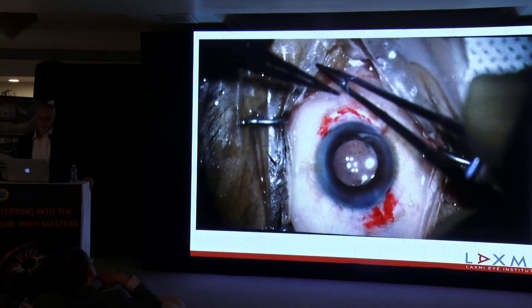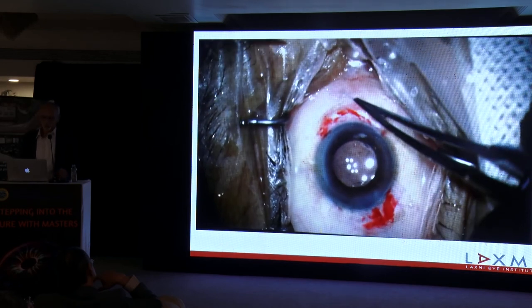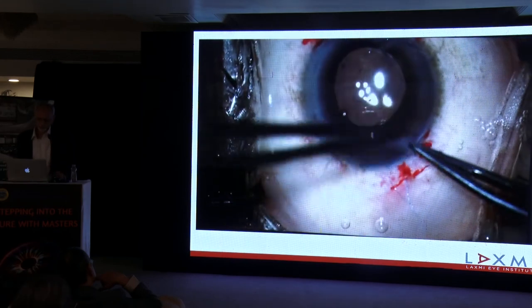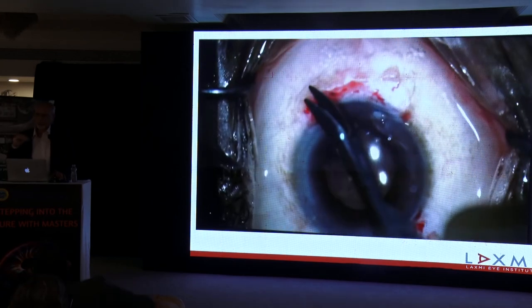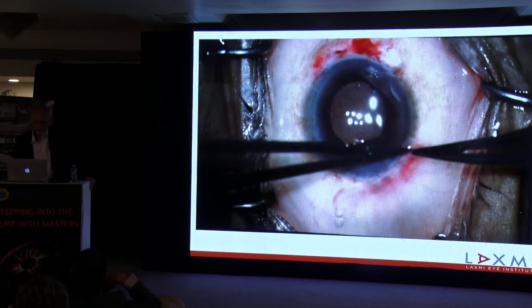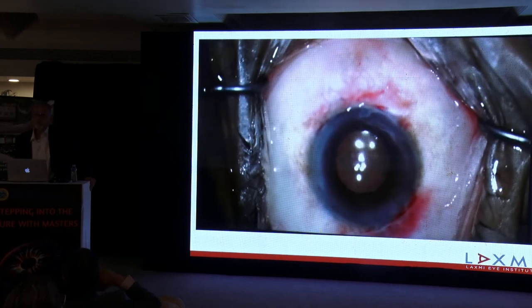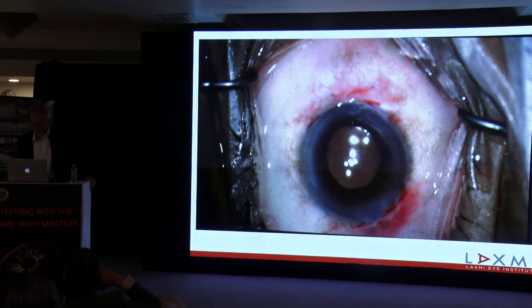And after the viscoelastic is washed out, the final step is to tie those sutures on either side a little tightly. And of course here I just made a groove, I didn't make any scleral flap, and the ends were left, and the conjunctiva was put back using glue. The patient was explained that by evening or next day you will have discomfort, you will have pain, and if you get all this, be happy.